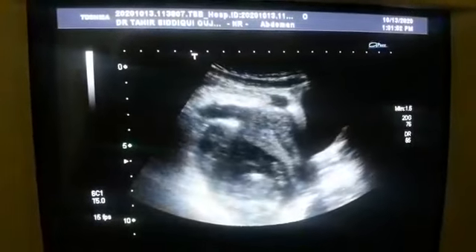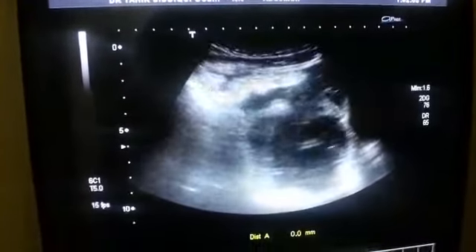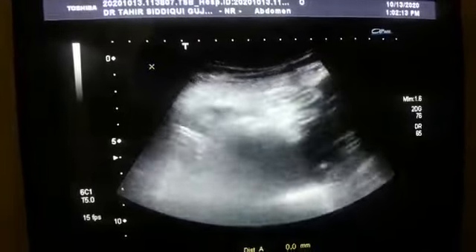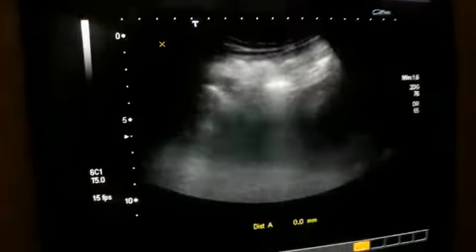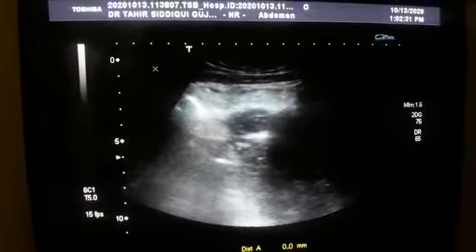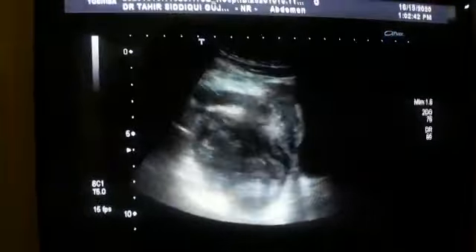Having seen that, once again, this is the urinary bladder, and you see this is the mesentery. She's lucky in a sense that the bleed is in fact bounded by the mesentery. Had it not been there, it would have spread. It must have gone up in the paracolic gutter, or in the Morrison's pouch anterior to the liver, but that is not the case here. It is bounded by the mesentery, this bleed, this collection.